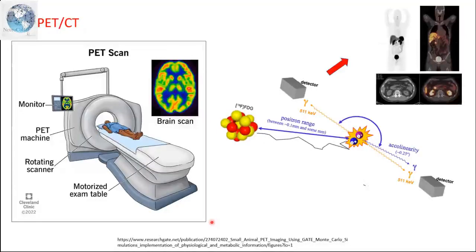Okay, so the PET-CT imaging is a quite common looking scan which has a donut, you know, the patient goes into the donut and then a scan occurs. What is different from CT scan? CT scan is the donut itself releases the X-ray. So there is a tube. The CT scan tube releases the X-ray to the patient and then you get the image at the detector. The difference for the PET scan is the machine itself is not radioactive. You inject into the vein a radioactive material and it distributes in the patient's body and that radioactivity is detected by the scanner. So the patient's body contains radioactivity. Okay, so that's the difference between CT scan, X-ray, and nuclear medicine imaging.